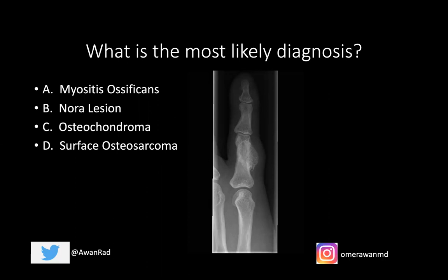What we're seeing here is a disordered mass that is ossified. We can actually see trabeculae coursing through this lesion. It's arising from the metadiaphysis of the bone. There's some surrounding soft tissue swelling here as well. We don't see any periosteal reaction, no major aggressive features. There's a pretty narrow zone of transition — I can literally take a pencil and outline the borders of this lesion.